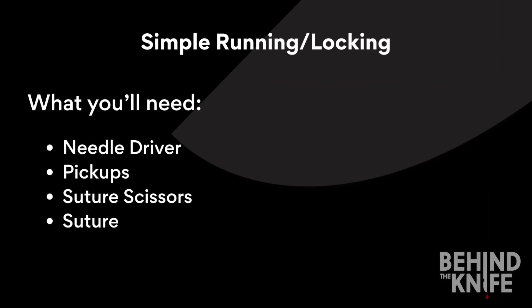Today we are going to learn how to perform a simple running suture. For this you will need a needle driver, pickups, suture scissors, suture, and your behind-the-knife suturing board.